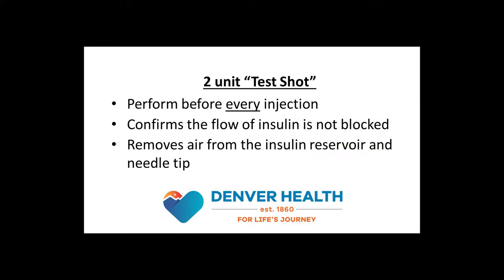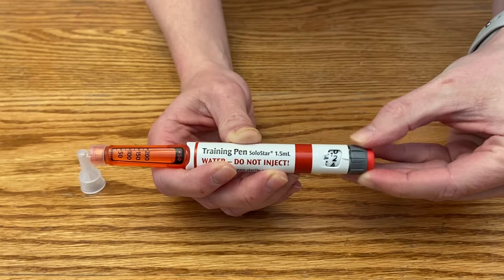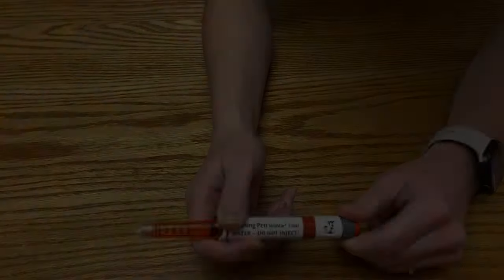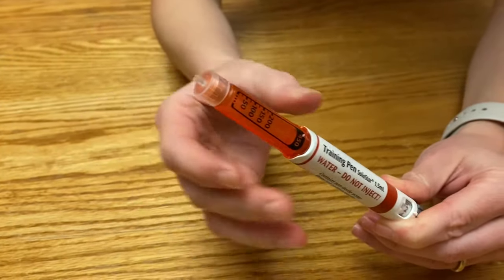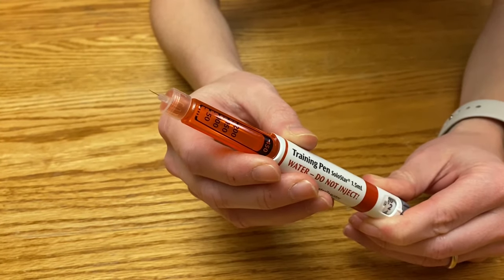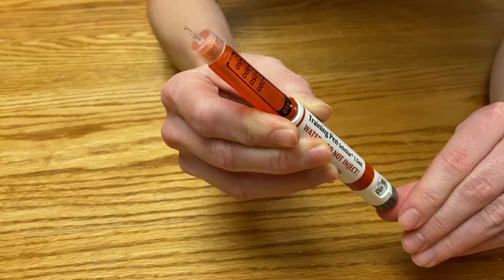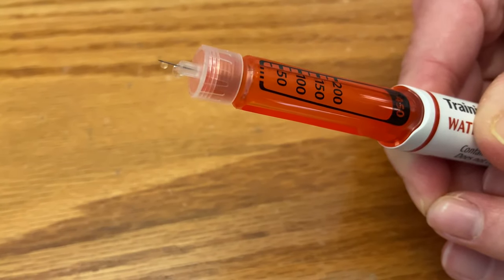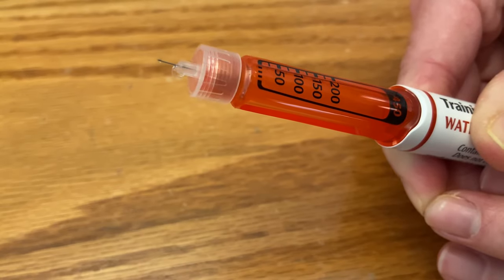The next step is to perform a test shot to make sure there are no blockages to the flow of insulin and to remove potential air from the tip of the needle. To do this, turn the dosing dial on the pen until it says 2 in the dosing window. Next, hold the pen with the needle pointing straight up. If you see any air bubbles in the insulin reservoir, gently tap the pen until the bubbles move to the top. Then press the dosing button. You should see a few drops appear at the tip of the needle, or a small stream of insulin can also shoot out.